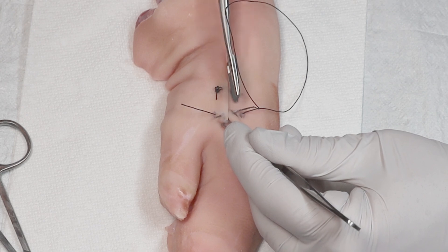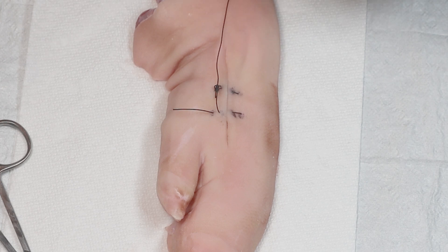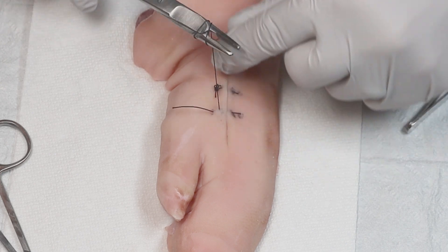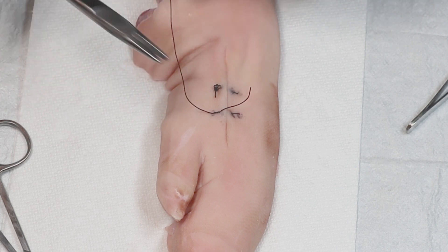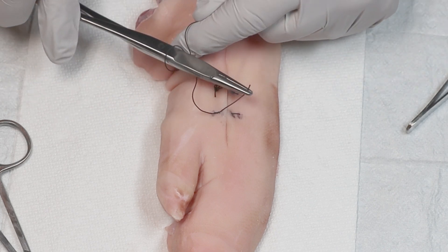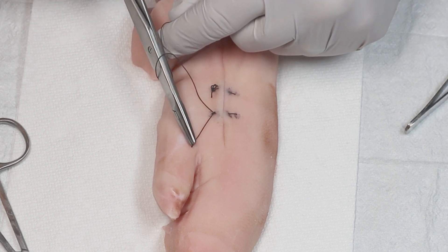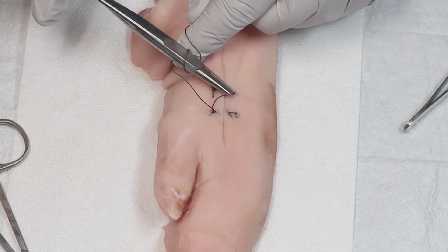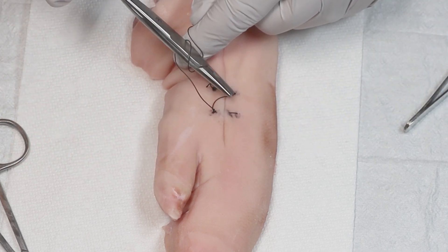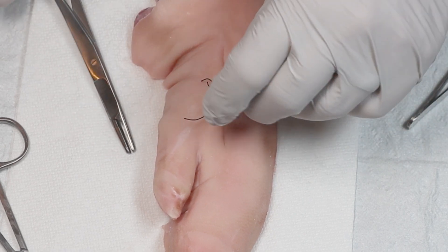Remember, the knot is tightened only until you get it approximated and you have eversion of the wound edges and they're together. You want to approximate — you do not want to strangulate. Too tight and there's a higher chance that the suture material cuts into the skin. Remember that some swelling will occur during wound healing itself, so you don't want it to be too tight. So you're doing your instrument tie — looking good. And there you have another vertical mattress suture. That's the utility of the suture.